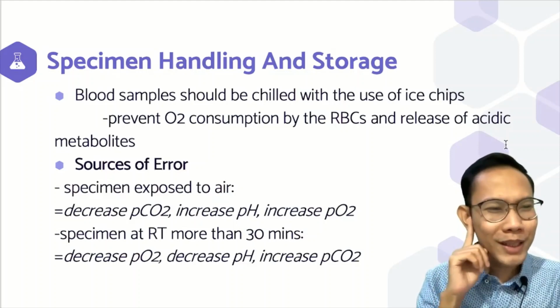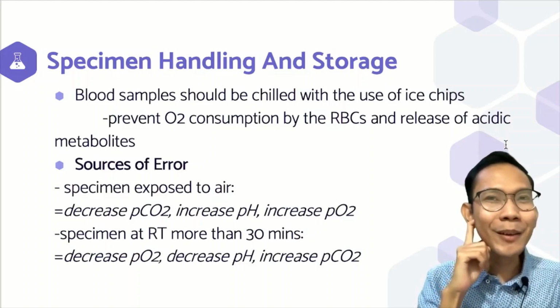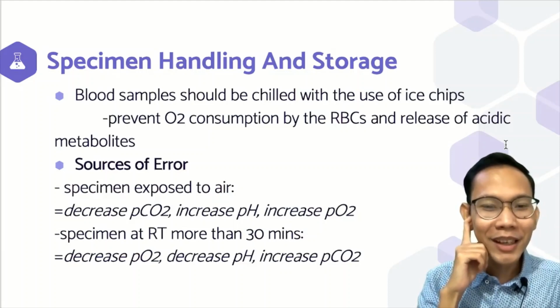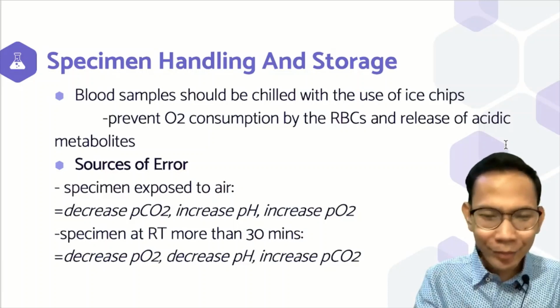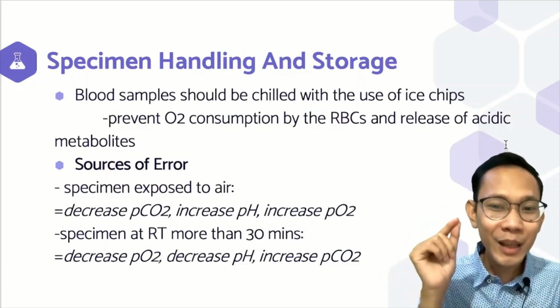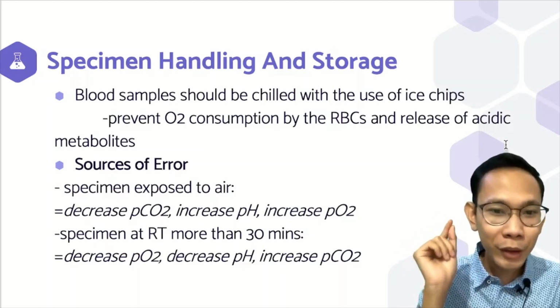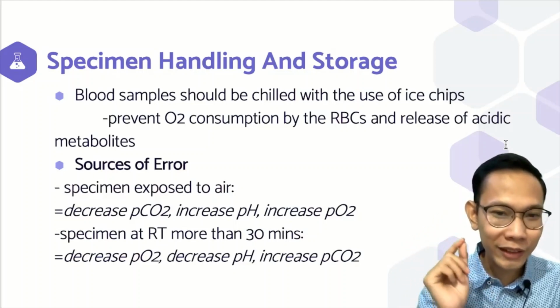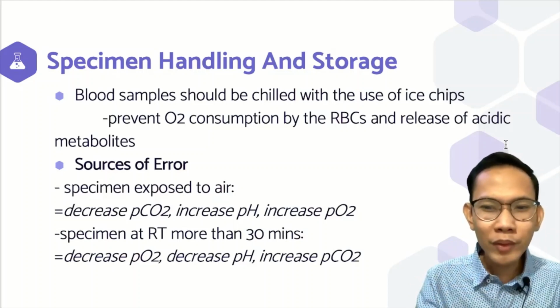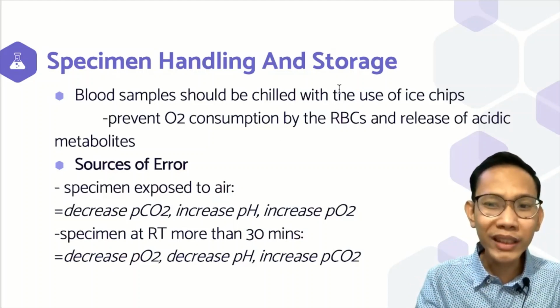But usually, no, pag ito nagta-time sa amin usually sa emergency room when I was an intern sa SPMC, pag ito talaga agad-agad kami kukuha ng sample and kami na din yung nagsasubmit ng sample patungo sa respiratory department kasi sila yung nagte-test sa SPMC. So we have to wait the result agad-agad. So most of the time wala na talaga itong chilled na use of ice chips.